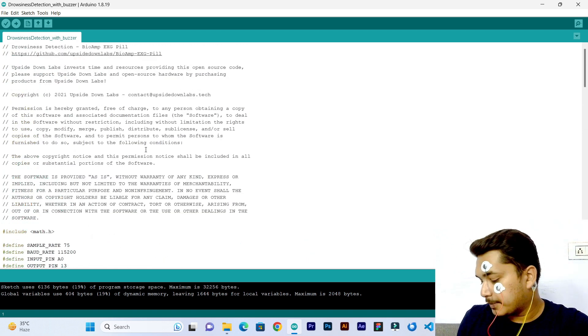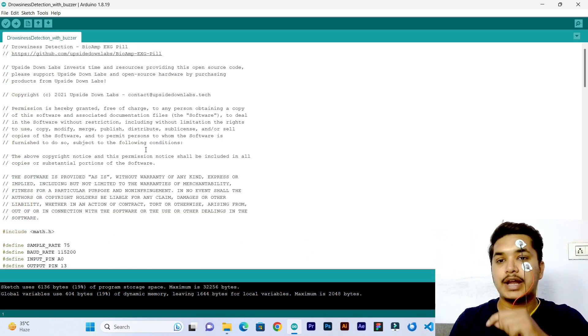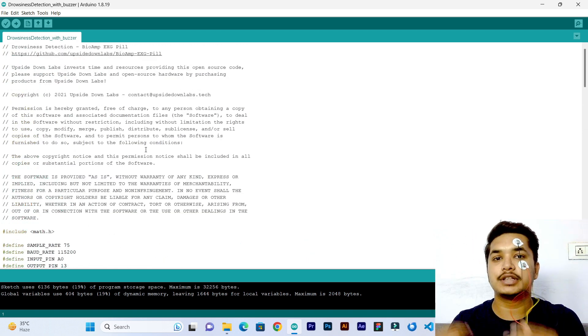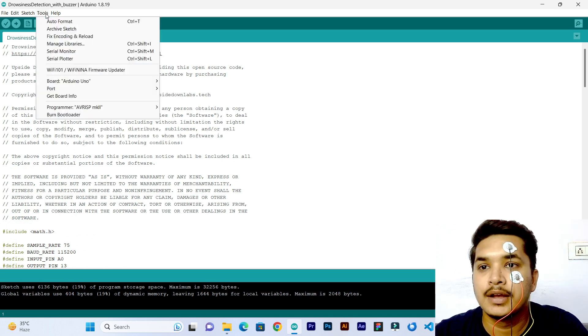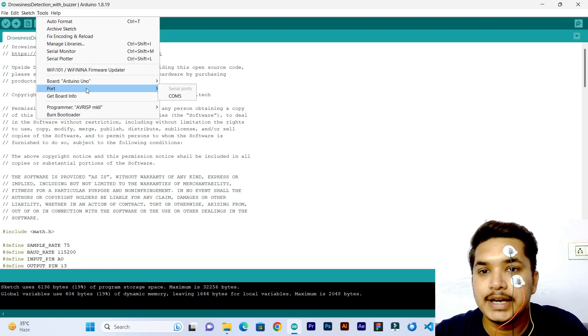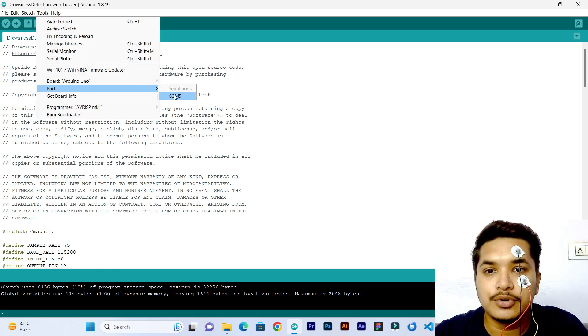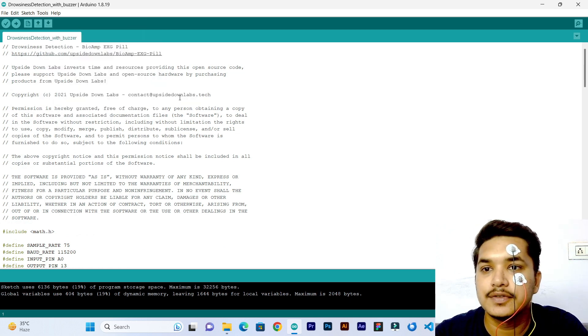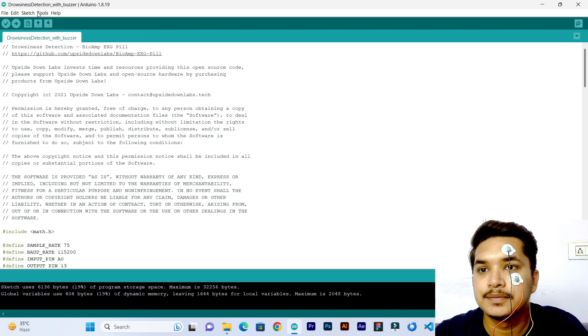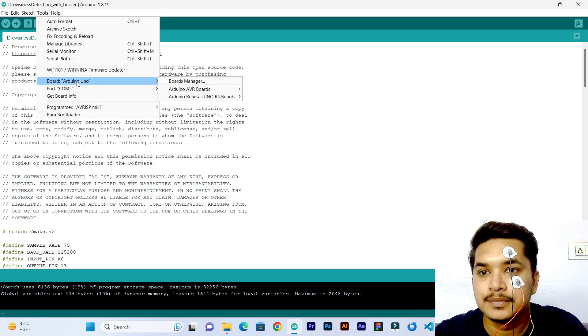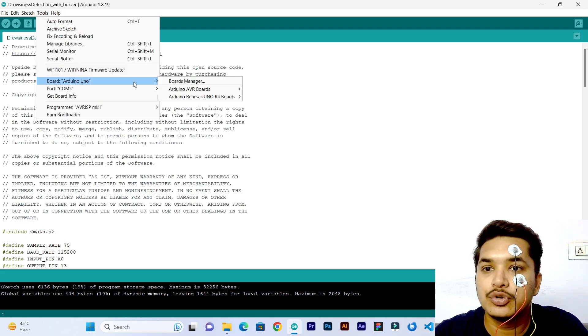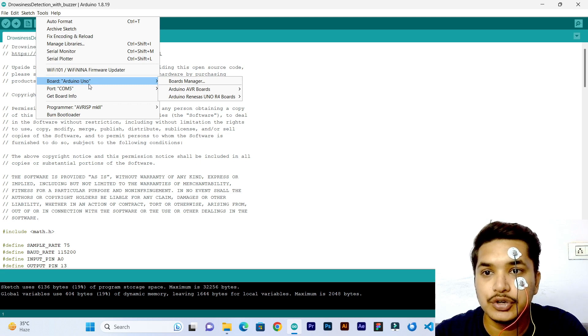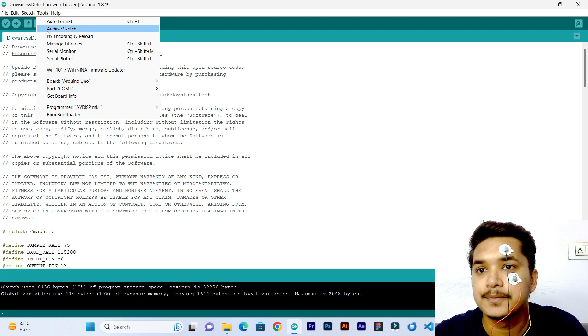Now I will connect the Makeruno to laptop using this USB cable. Let's select the com port - for us it is COM 5. As it is Arduino Uno compatible board, we will have the Arduino Uno board selected here.